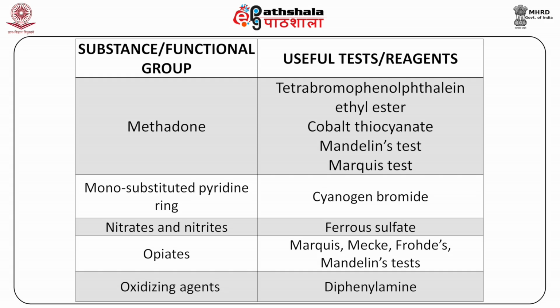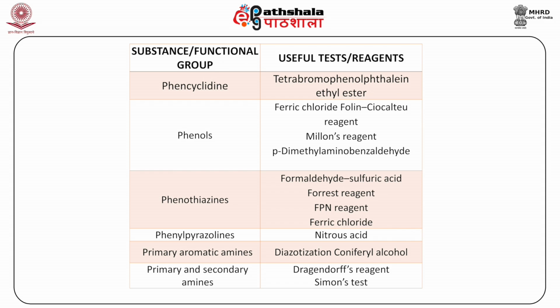In case of opiates, Marquis, Mecke's, Froehde's and Mandelin tests are carried out. In case of oxidizing agents, diphenylamine is used. For phencyclidine, it is tetrabromophenolphthalein ethyl ester.